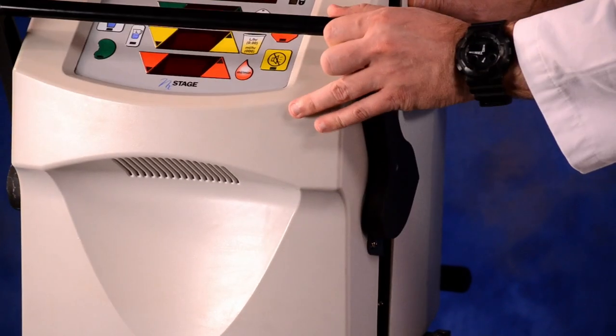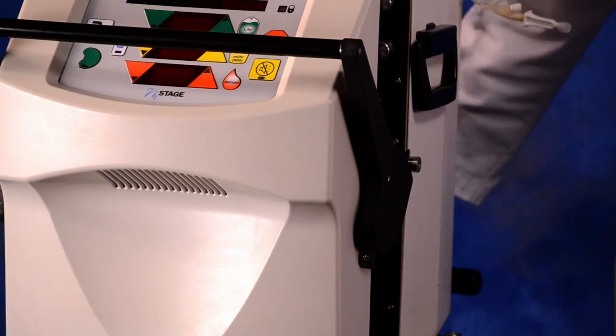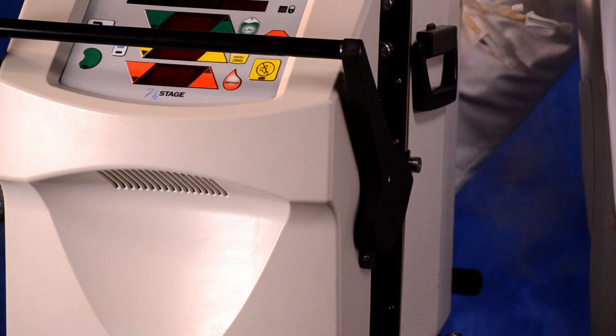We'll start with setup. Gather and inspect your supplies. Open the cycler door completely and leave the handle up. Turn the cycler on. Wait for the yellow bars to flash.